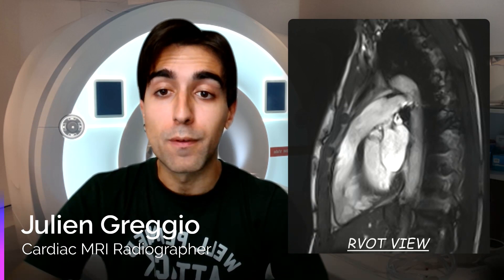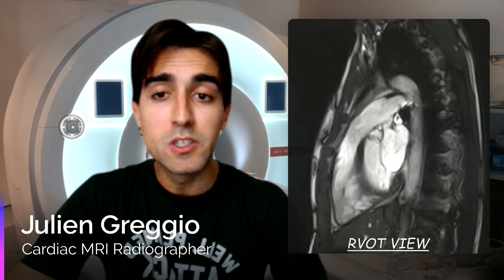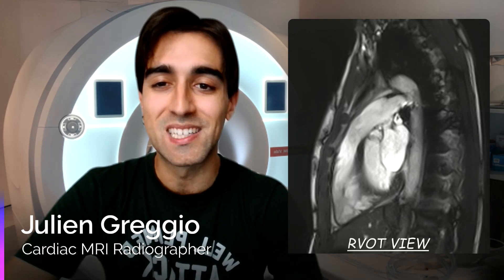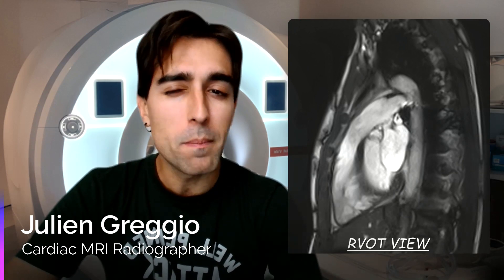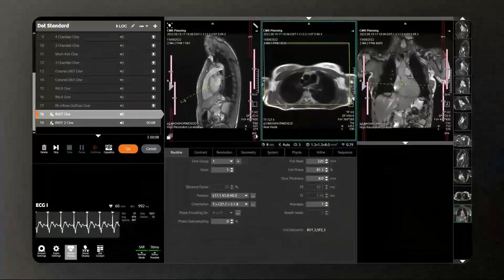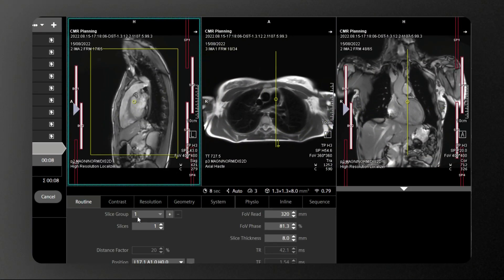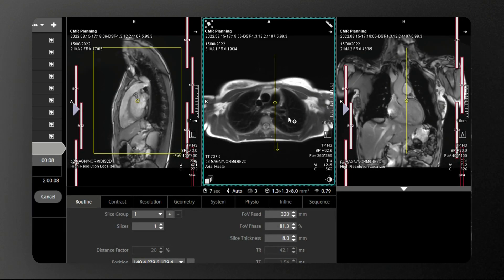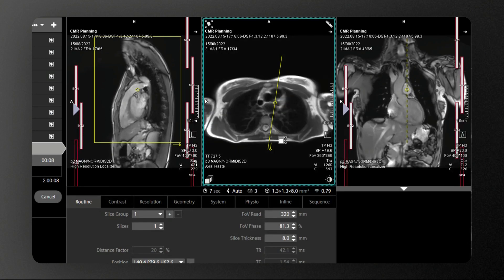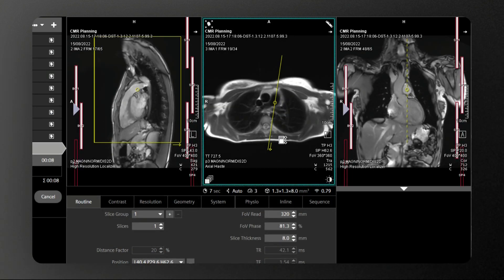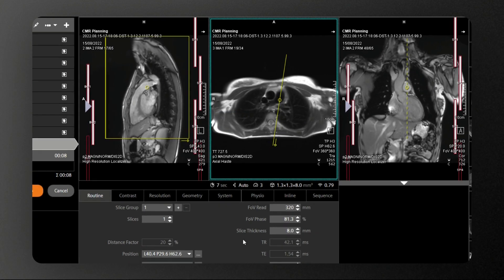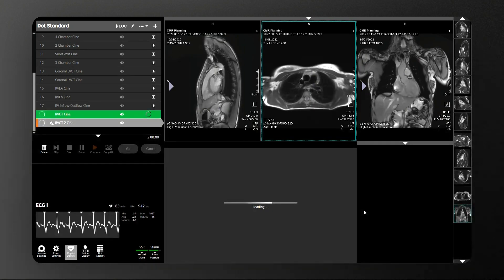We are talking about the Right Ventricular Outflow Tract, better known as the RVOT, whose acquisition is essential to properly assess the pulmonary valve. The RVOT cine can be tricky to plan. Ideally, we start by copying the image position of one of the sagittal images from the localizer — try to copy the position of an image giving a good overview of the main pulmonary artery. Then click perpendicular on the axial view and locate a set of images where you can properly assess the main pulmonary artery and its bifurcation. Prescribe the slice through the narrow waist point of the RVOT and into the right ventricle.